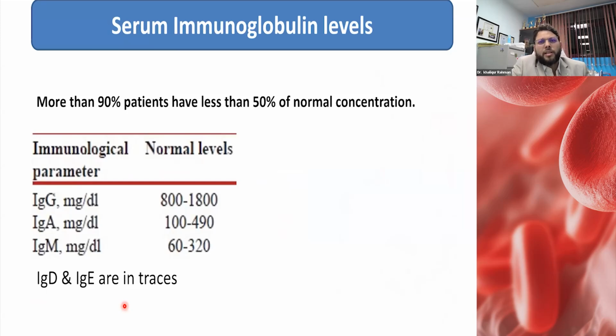Serum immunoglobulin measurements are also done, and as I said earlier, more than 80-90% of patients have subnormal concentrations of immunoglobulins. Measuring immunoglobulins also helps in certain rare conditions where we find only light chains and no corresponding heavy chain in the electrophoresis. Mind you, remember that serum immunofixation was only done for IgA, IgM, IgG, kappa, and lambda. So, if we find only kappa and lambda in immunofixation without any corresponding G, M, or A, we can call it light chain myeloma.